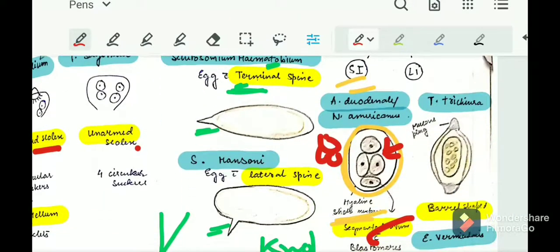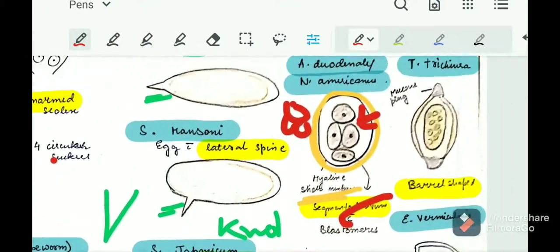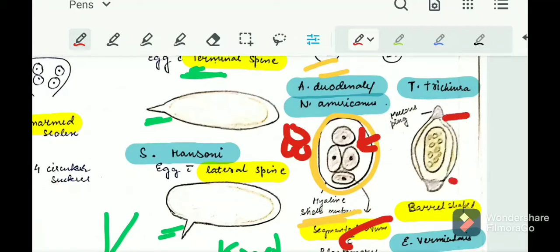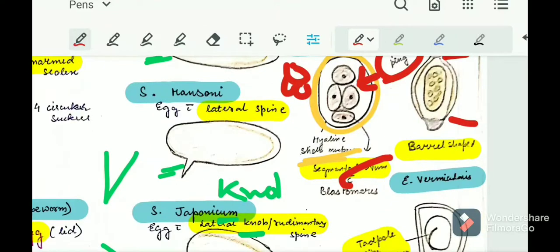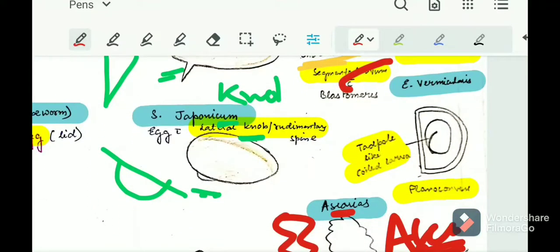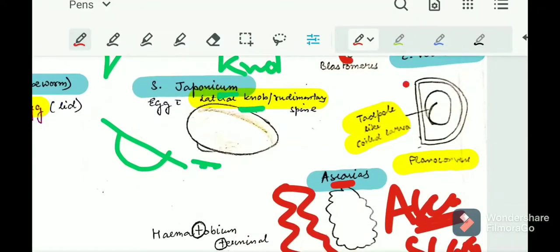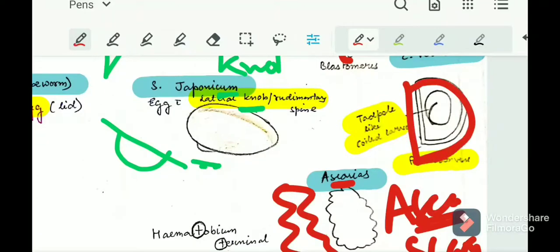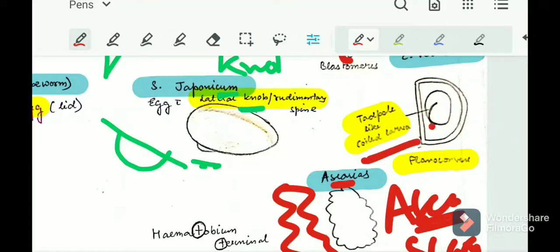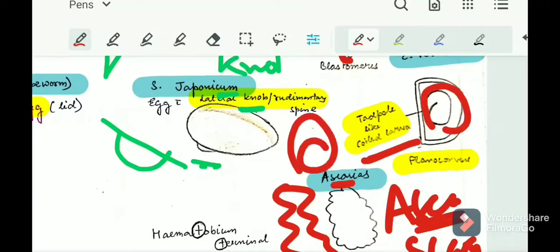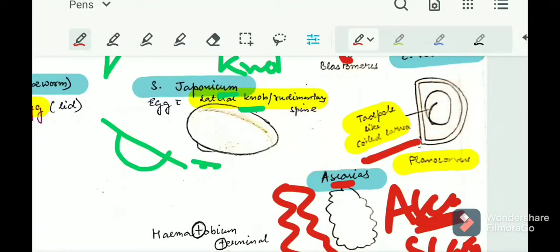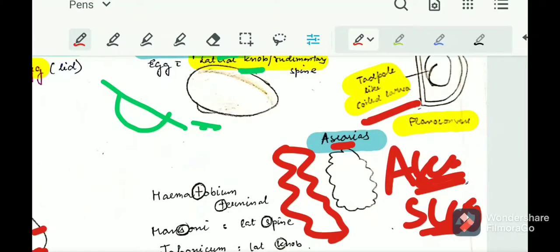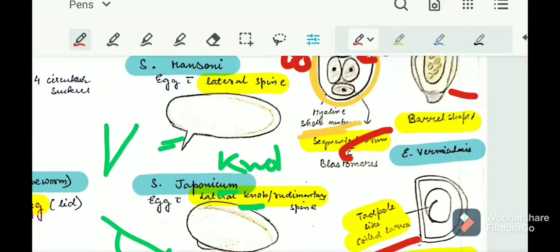Large intestine nematodes include Trichuris trichiura and Enterobius vermicularis. Trichuris trichiura is easy to identify — it is barrel-shaped with mucus plugs at both the bipolar ends. Enterobius vermicularis has a plano-convex egg with a tadpole-like coiled larvae inside. So a plano-convex egg with a coiled tadpole-like larvae is Enterobius vermicularis.